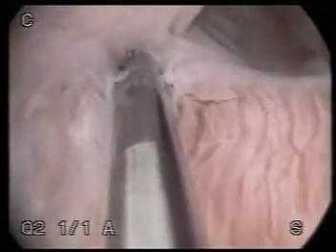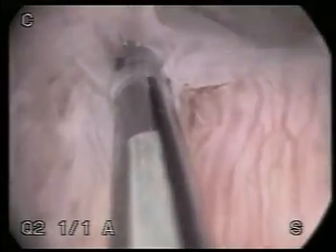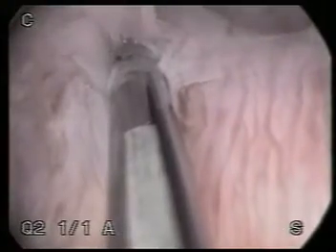When it is time to leave the site, cease injecting. Wait 15 seconds and slowly remove the needle from the site. Slight extravasation of Durasphere may be observed. Our objective is achieved with excellent closure at the proximal urethra.